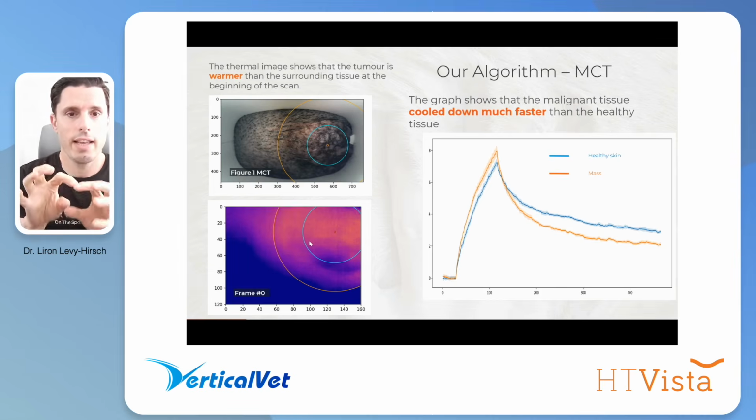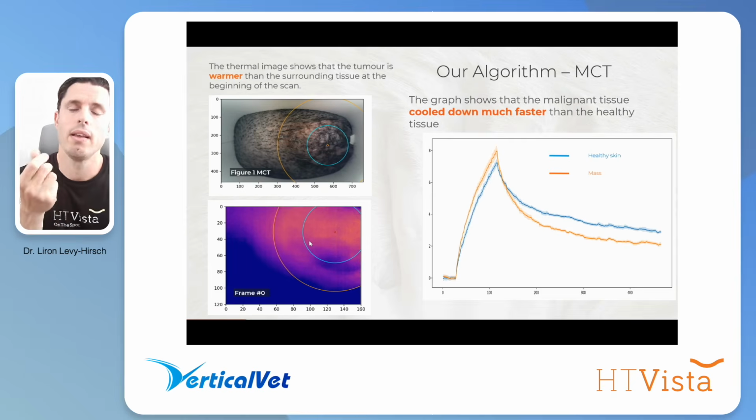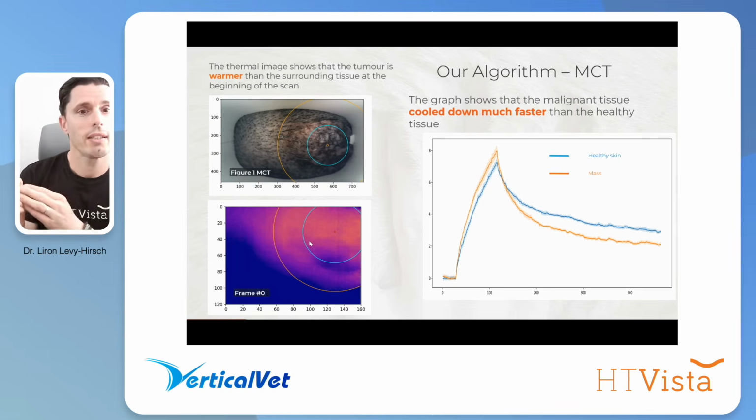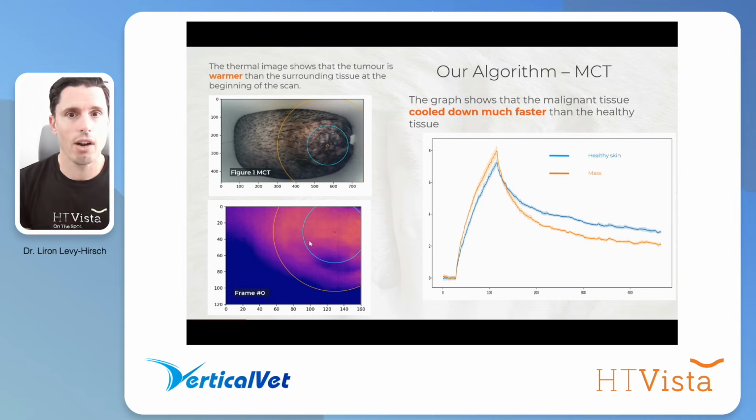So you can see that within the first circle, the first marker, the blue marker, that's where the mast cell tumor is. The tissue is already much hotter than the surrounding tissue, which is the blue area. And what the device actually does, it uses the blue area, the healthy tissue, as a reference point to let us know what it thinks about the area that is included within the first marker. So in this case, the algorithm concluded that there is a high cancer risk.